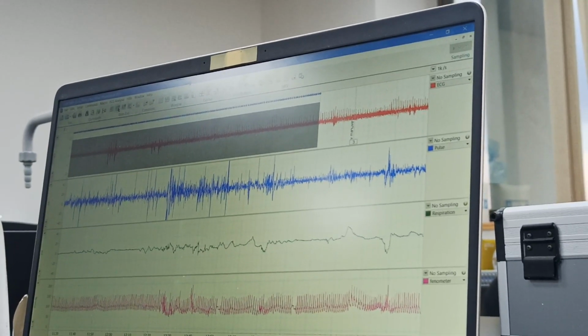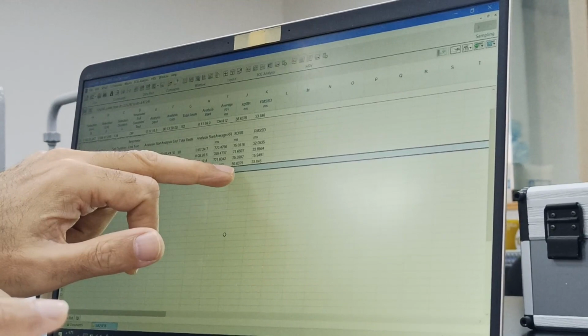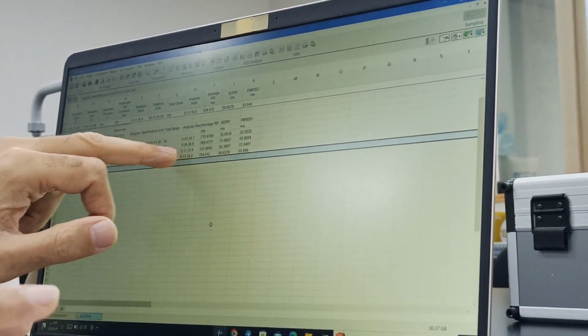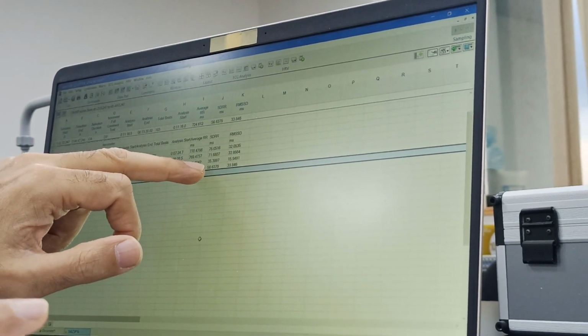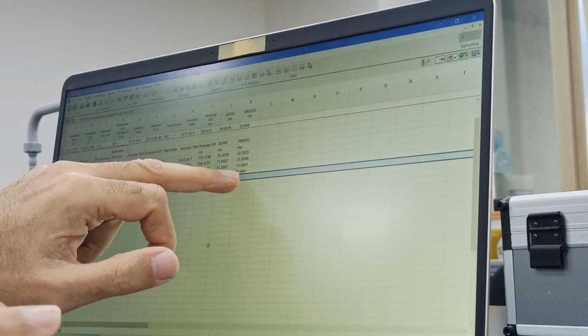Now if I just add that up and see, the difference becomes less. Because of the short segment of only 48 beats, it became 36 and 15, and now back to 56 and 33.